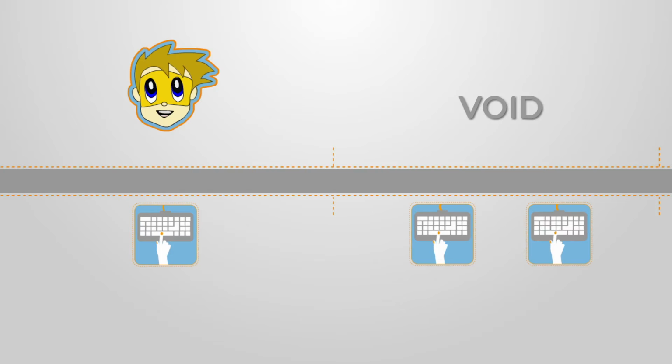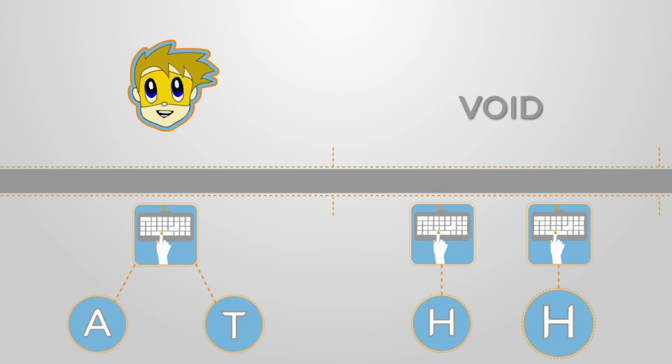If the key is pressed 3 times instead of only once in response to the target element, but the first keystroke occurred while the element appeared on the screen, it will be categorized as correct attentiveness and correct timeliness. The 2 extra keystrokes will be categorized as hyperreactive commissions.